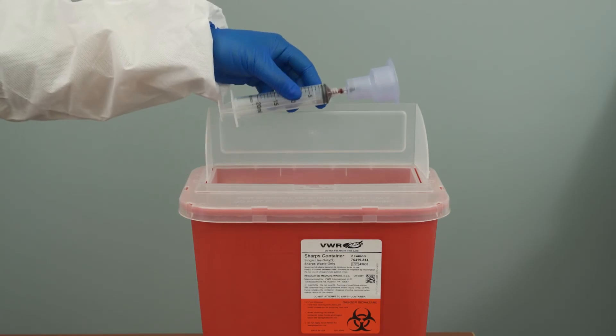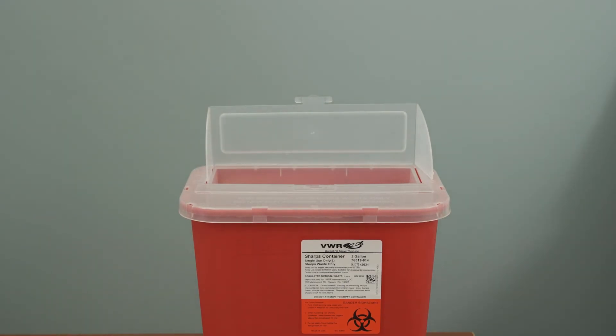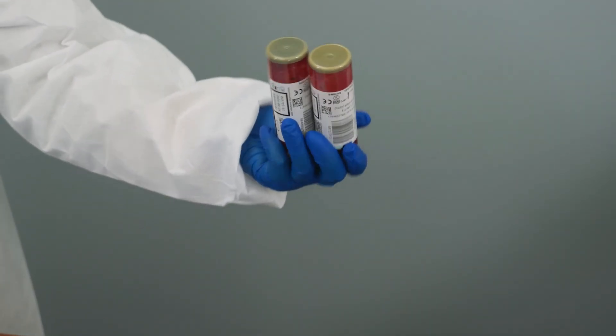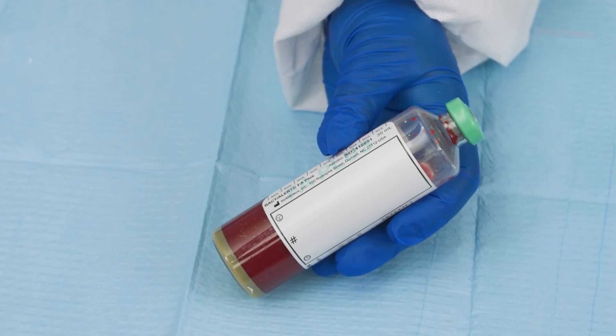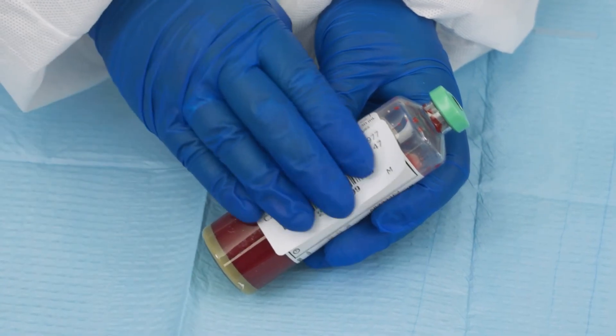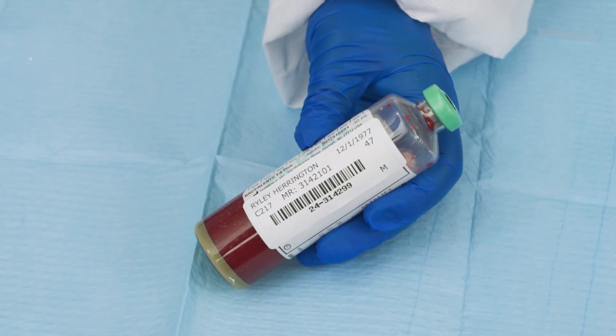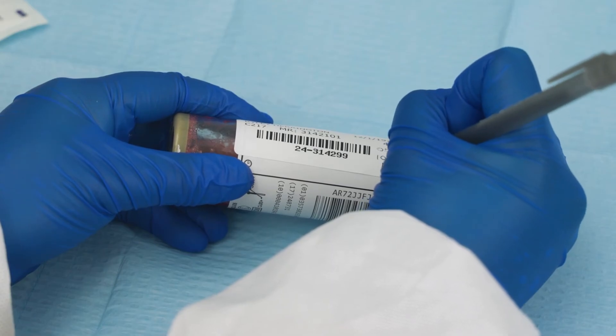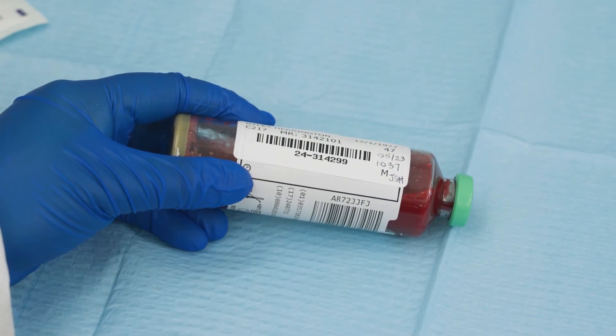Discard the syringe and adapter into a sharps container and dispose of other materials. Mix blood culture bottles and tubes by inverting 3 to 5 times. To properly label the bottle, use the dedicated area on the bottle. If using a test label, place the barcode label vertically so the orientation is the same as the bottle barcode. Do not cover any of the bottle barcodes, the fill-to mark, or the window to check the blood level. Add any additional information if required, such as date, time, and collected by. Ensure that any additional labels do not cover the bottle barcode.